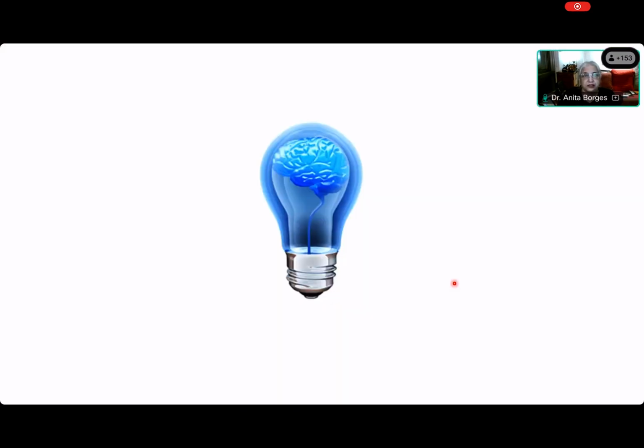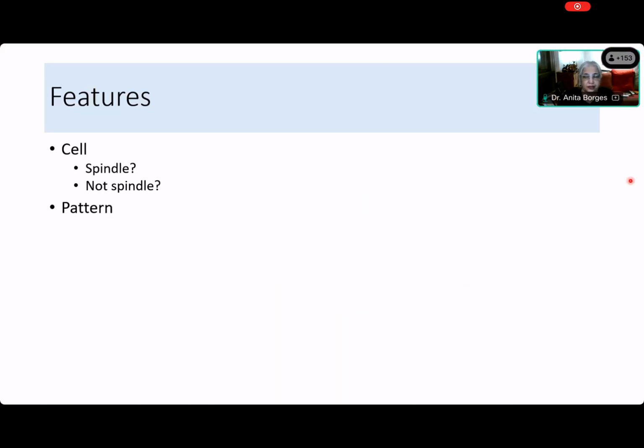So now, come on, tell me. Is this a spindle cell tumor? Yes, ma'am. Very good. What is the pattern? Palisading. Yes, it is pseudocystic and palisaded. You have to notice that this is pseudocystic.